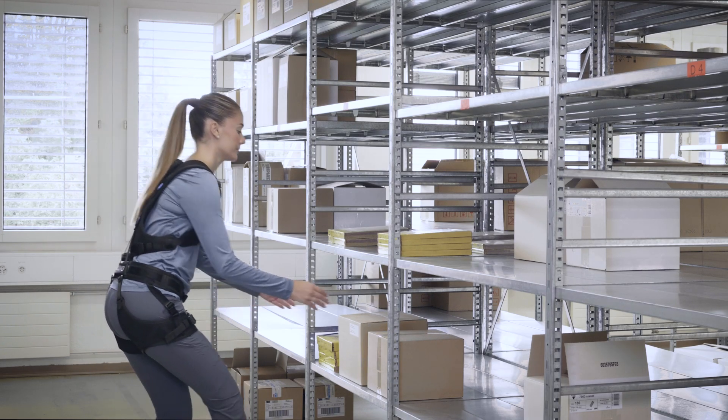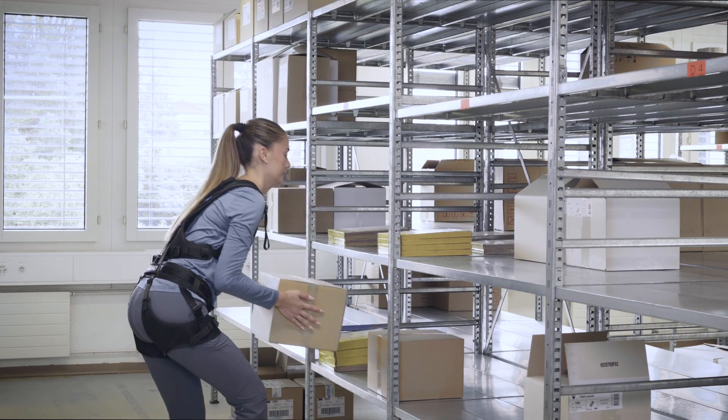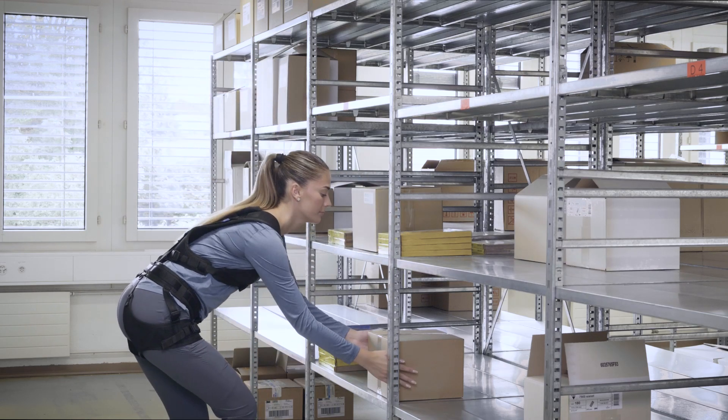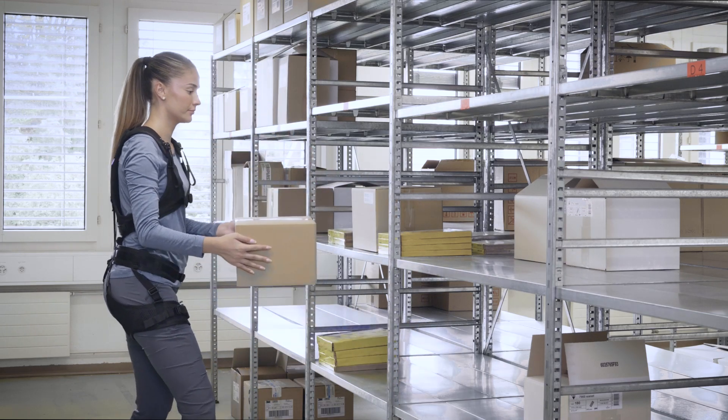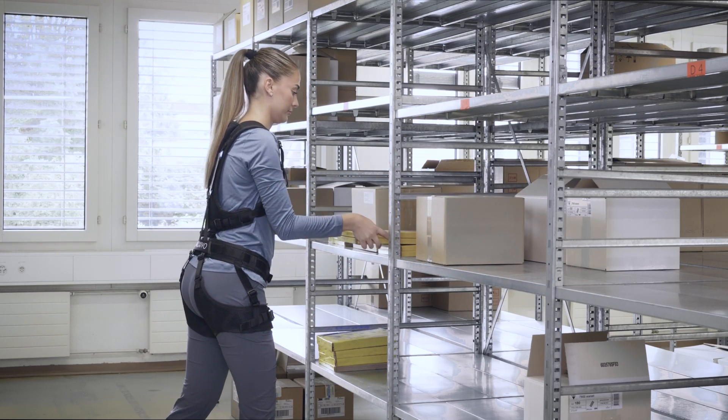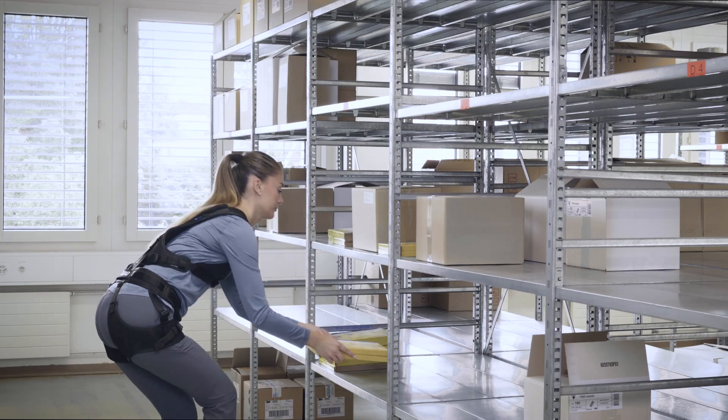When you start using the LiftSuit, your work will feel somewhat different. Therefore, we advise that you take some time to get used to it. Work with it for a maximum of one hour during the first day, and then increase the time step by step until it feels completely natural to wear it all day.